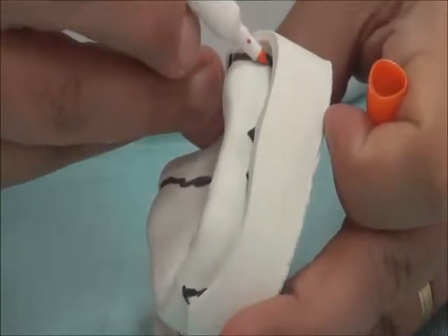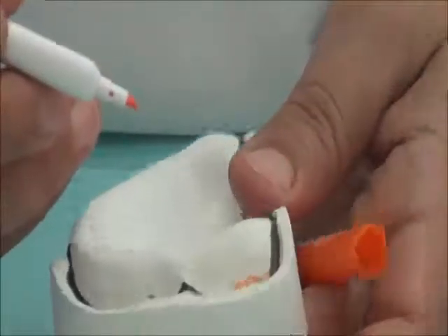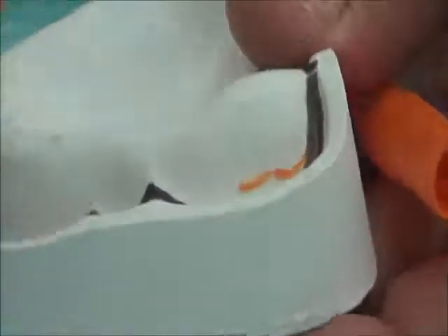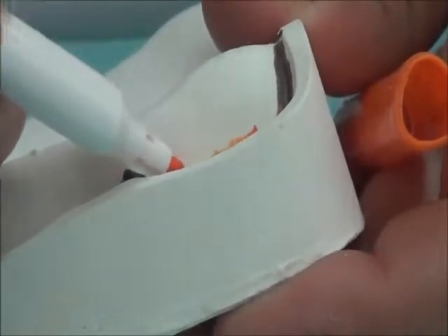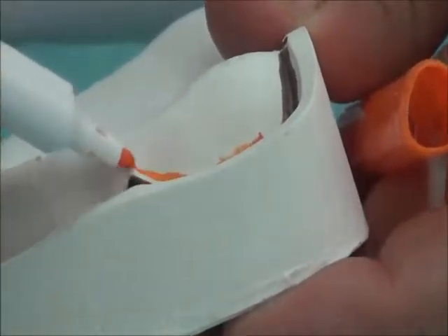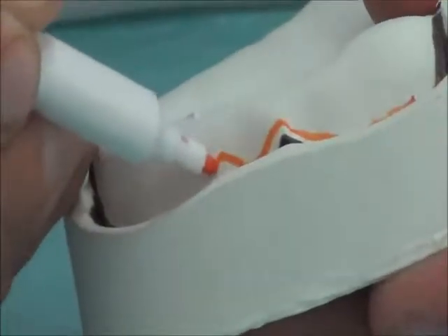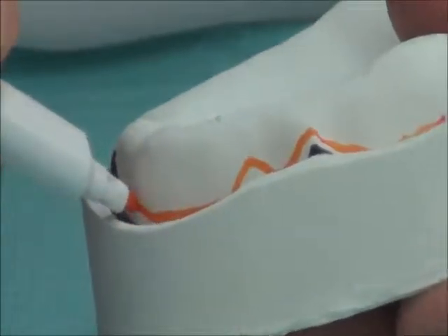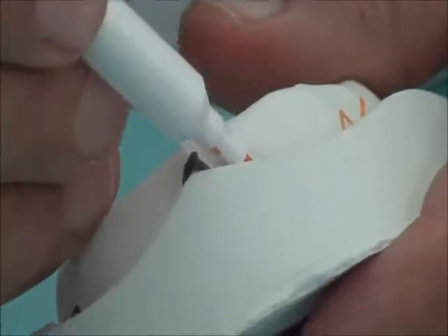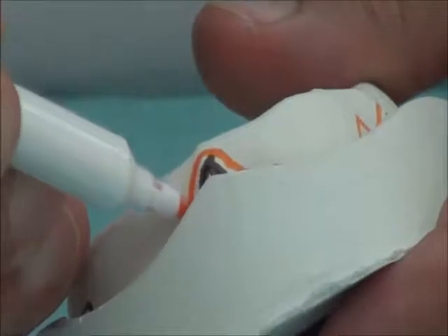That's why we drew the first line, to make sure that we are drawing 2 millimeters to 3 away from the sulcus. And once more, we follow the same morphology. So on the freni area, we have to make these notches. We follow on the labial area. We follow to the labial frenum, and once more allow clearance for the labial frenum.